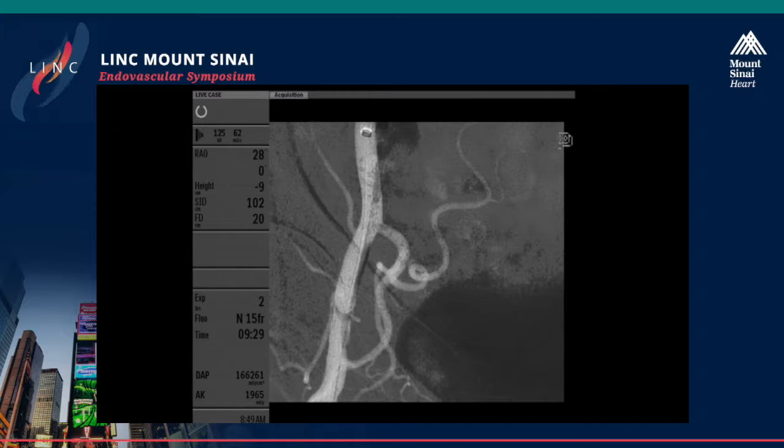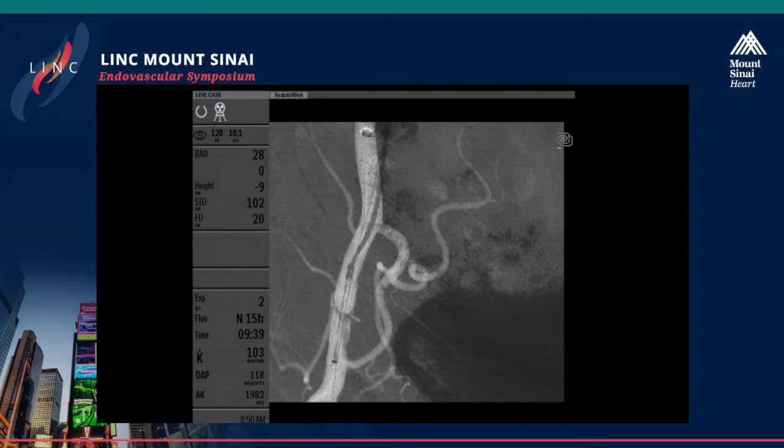Yeah, so to address the idea of what to do in a bailout, the data on this is relatively mixed. Very limited experience with stents in this location. Obviously they need to be nitinol self-expanding stents. One study showed they're superior. Most studies suggest they're inferior, and they interfere with subsequent interventions in that area. So by all means, I think you're right to avoid a stent. Your strategy is great, exactly what we would do. Directional atherectomy, and then drug-coated balloon. Interestingly, we've used some cutters in this location as well before drug-coated balloon angioplasty with some satisfactory results.